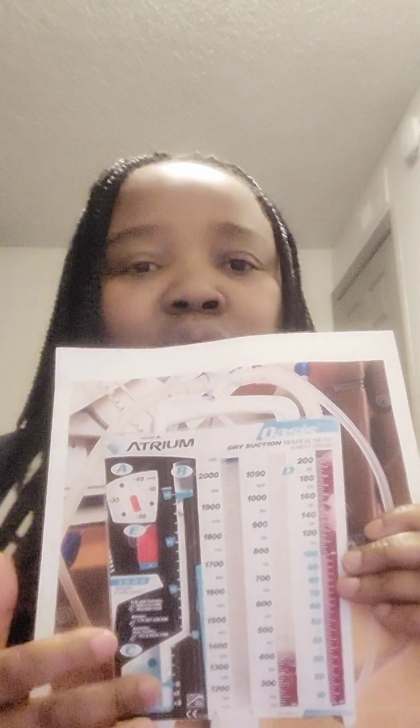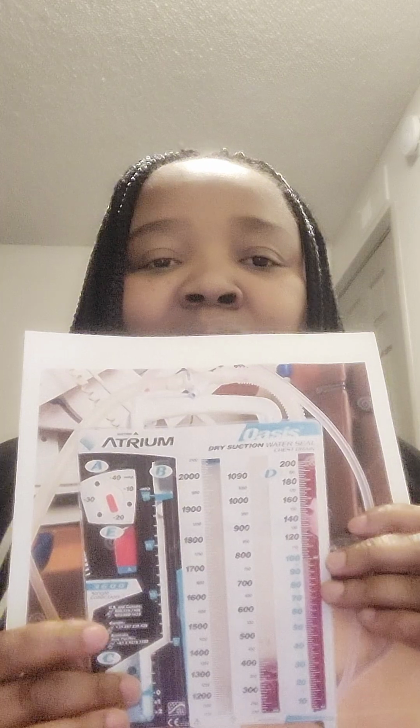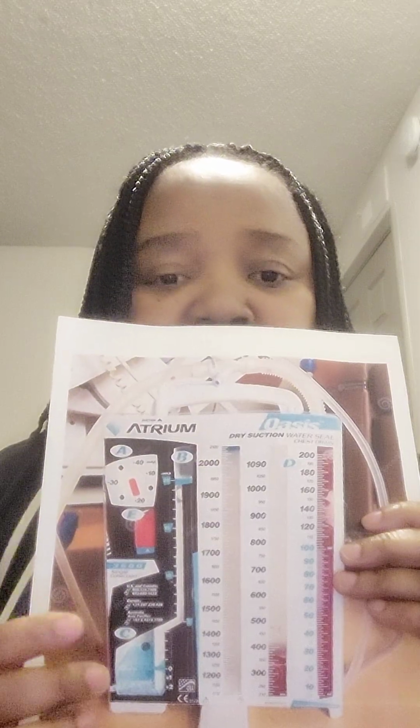So for starters, over here in the air leak monitor, if you see increased bubbling or constant bubbling, there is an issue. So you should reach out to the provider. But take note that if the indication for the chest tube treatment is pneumothorax, realize that what you are trying to achieve is get the air that is in the pleural space out of the pleural space.